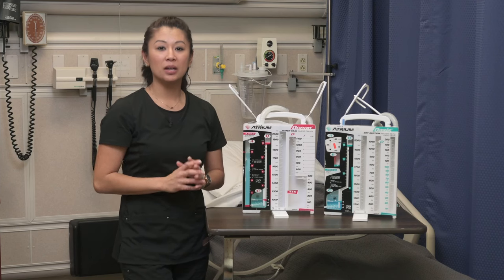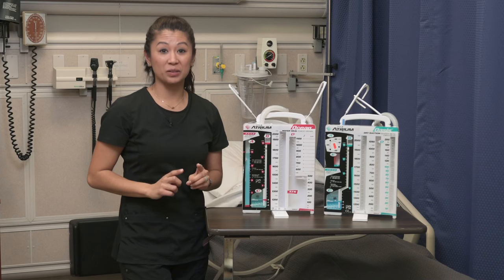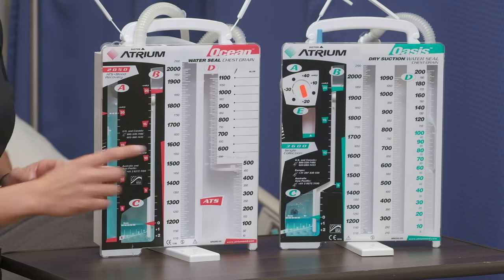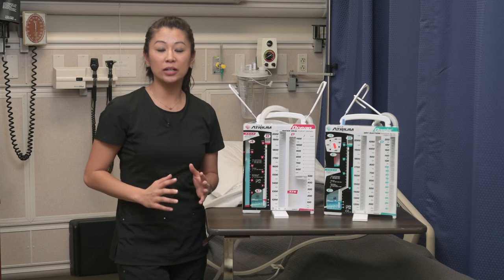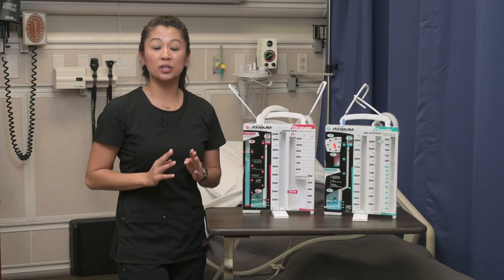Let's start with similarities. As you notice on both the dry and the wet, they both have those calibrated, marked, measured collection chambers. This is where you're going to see any drainage, any fluid, and especially blood.